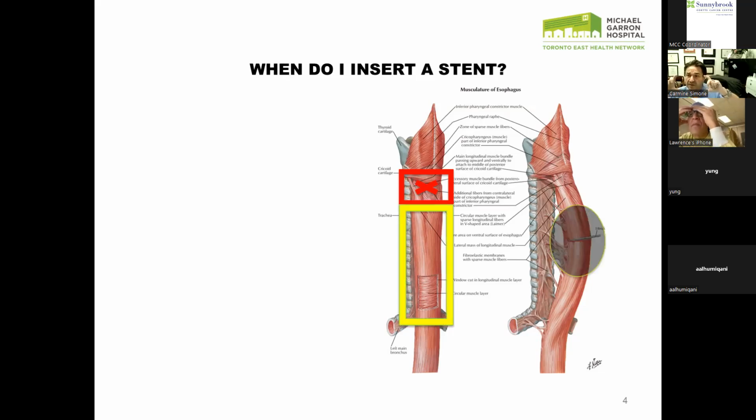The middle part of the esophagus, that's really yellow, I mean, with caution. It's usually really great to deploy the stent because both the proximal and the distal purchase are within the esophagus and allow for a very, very good deployment of the stent. Usually there's a very good waist if it's a bulky tumor, and so the stent has a very low risk of migration. So that's great.